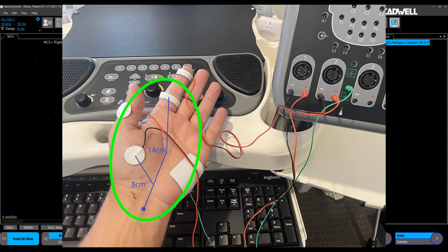I'm going to measure down your typical distance, whatever that is, probably 8 centimeters, and then measure up from those 8 centimeters up to the first digit or second digit to 14 centimeters, and that's where I'll place my active ring electrode. That allows me to use one stimulation and acquire both sites at the right distance.